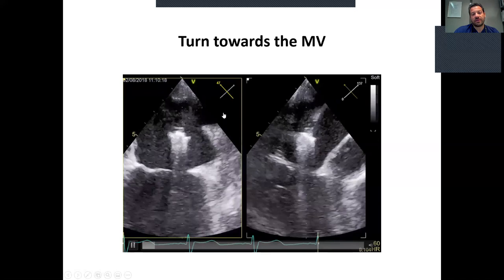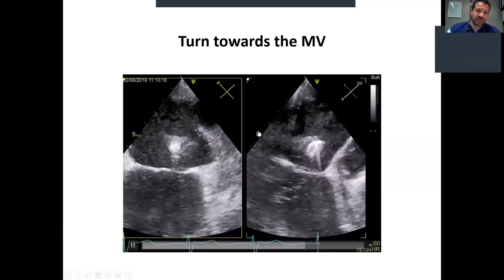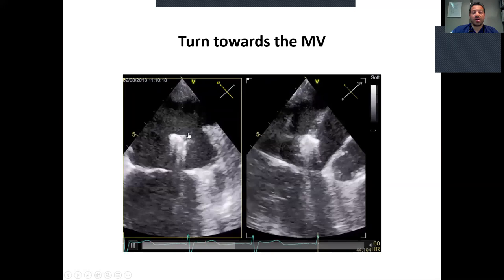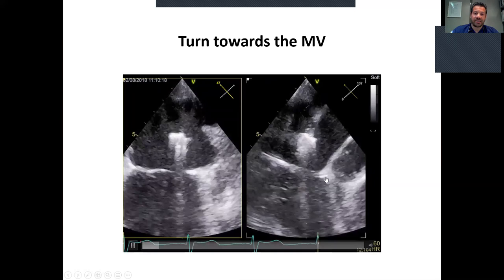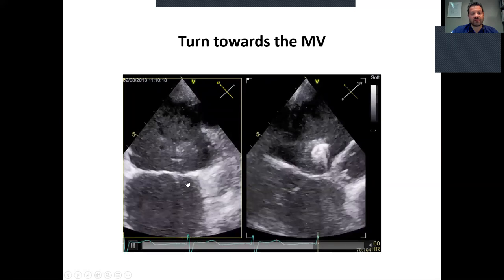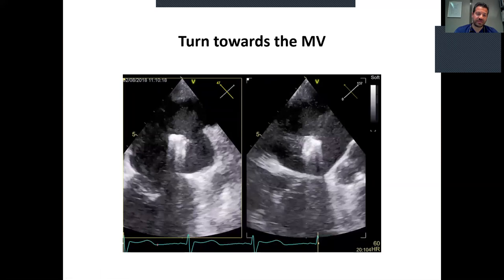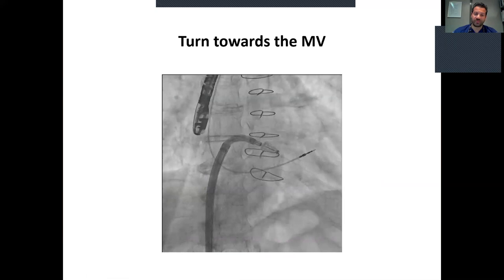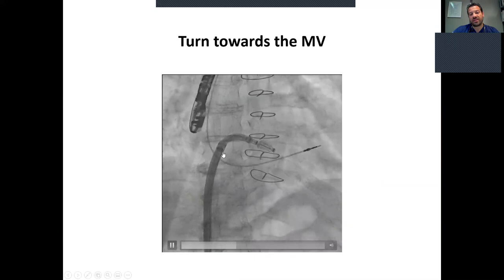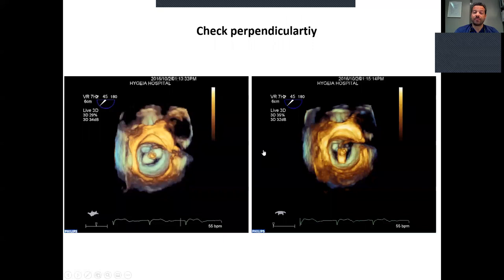Afterwards, we turn the Pascal system to the mitral valve, being careful not to touch the Coumadin ridge. We have to use biplane views — a commissural view and a long axis view — to guide our interventionist laterally, medially, anteriorly, and posteriorly. Remember that the lateral part of the mitral valve is where we have the left atrial appendage. This is the fluoroscopic view with the delivery system towards the mitral valve.